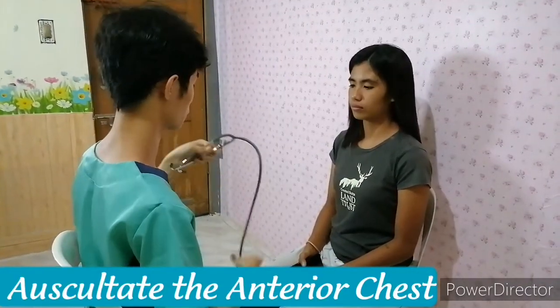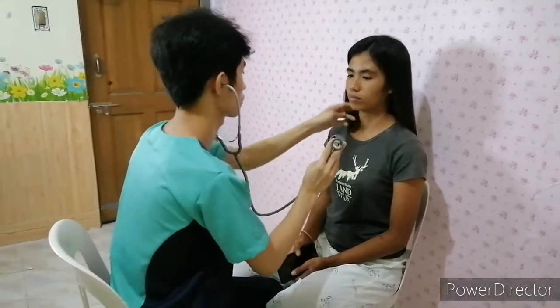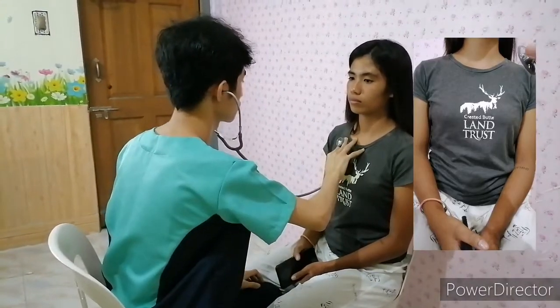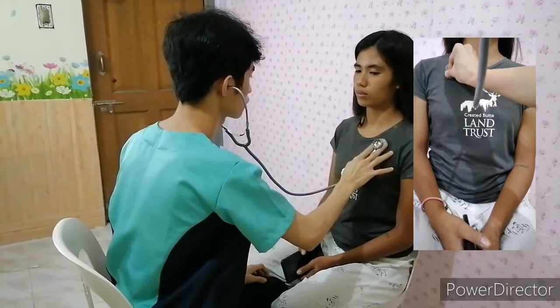Auscultate the anterior chest. First, place the diaphragm of the stethoscope firmly and directly on the anterior chest wall. Auscultate from the apices of the lungs slightly above the clavicles to the bases of the lungs. At the sixth rib, ask the client to breathe deeply through her mouth.